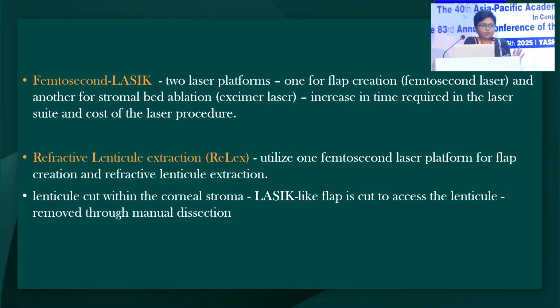So now we have femtosecond LASIK, but again we find it problematic because we need to create the flap with femto, and then shift the patient to the excimer laser. These two laser platforms are needed, so obviously you are paying bucks and bucks for it, and the entire time duration is extended. So now another concept came into picture: why not go totally dependent on femto only? That gave us ReLEx, or what we call KLEx now.